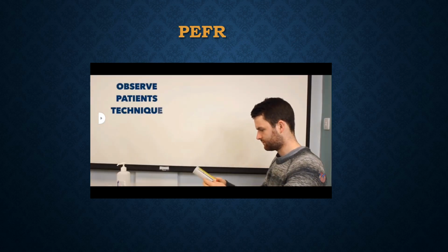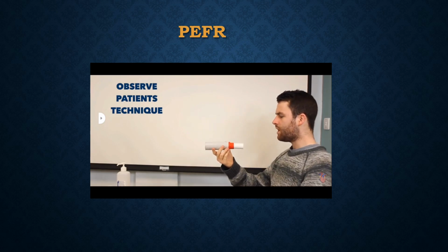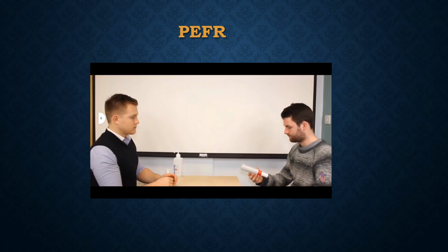This is a peak flow meter, as you can see. The patient is blowing air into the mouthpiece very forcefully, and we note the reading.